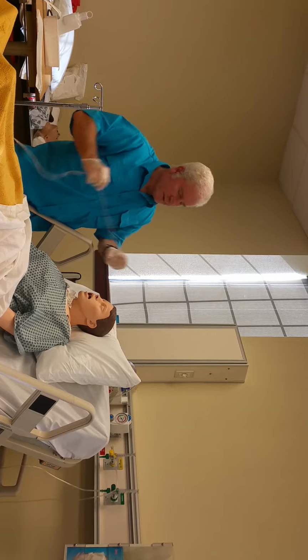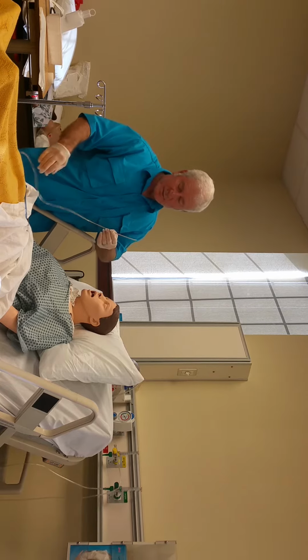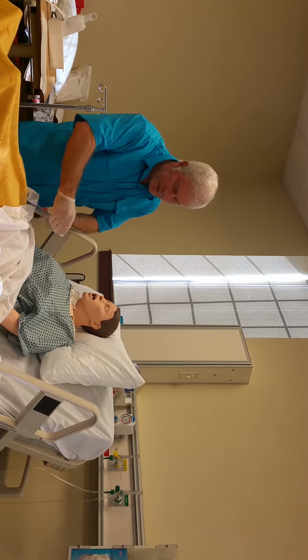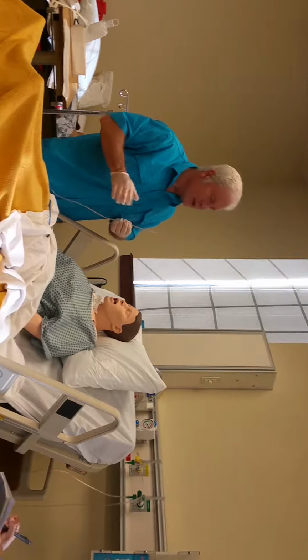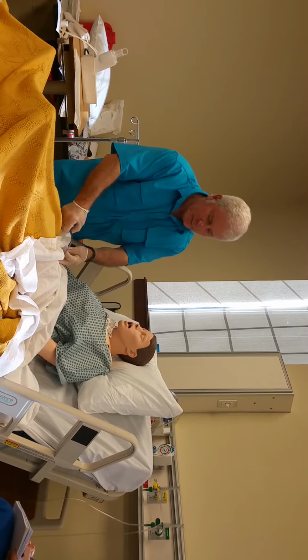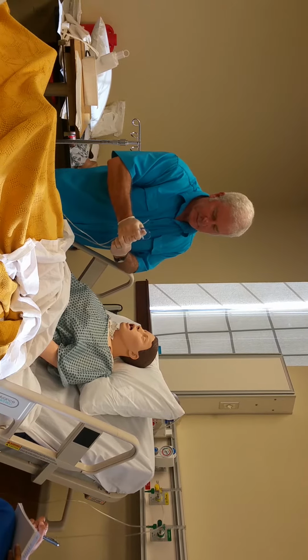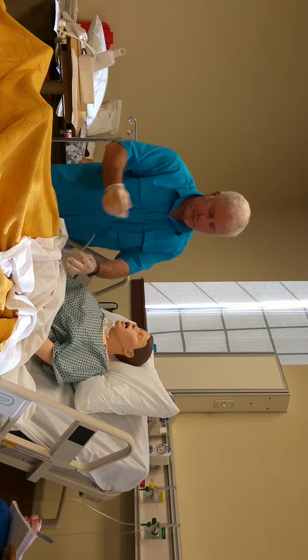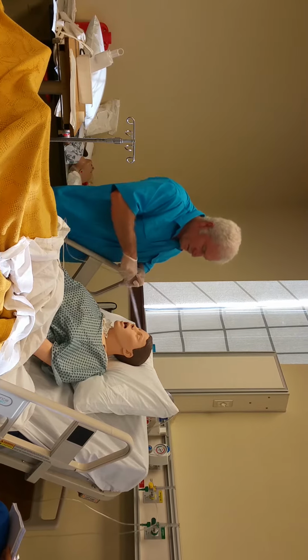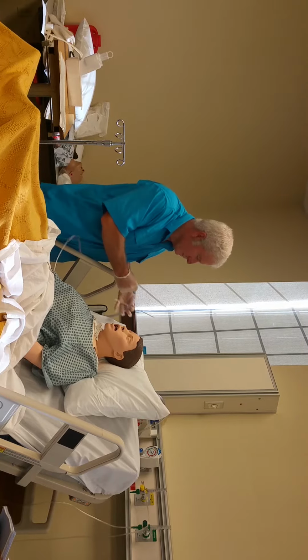If I had a Sharpie, I would do that, okay? So you're gonna explain to the patient, you can't do this without the patient's help, okay? So you tell him, okay, what we're gonna do is we're gonna insert this NG tube, and you wanna have it clamped before you get started, because if you don't, it's gonna run out. And this is your splice, so just go ahead and set it over here, so you'll be able to hook the two together.